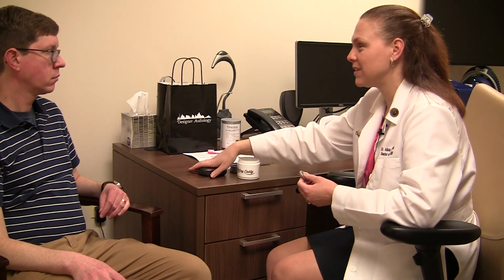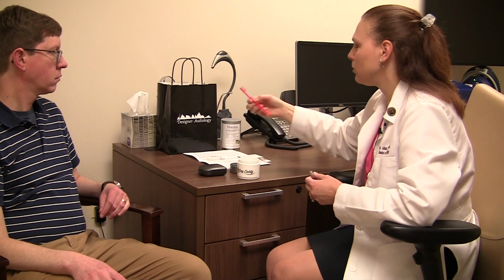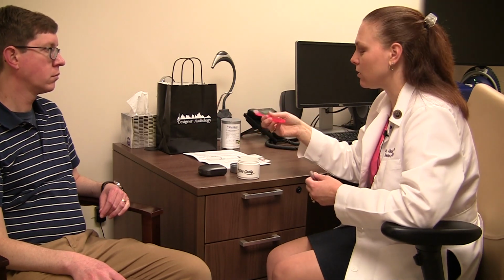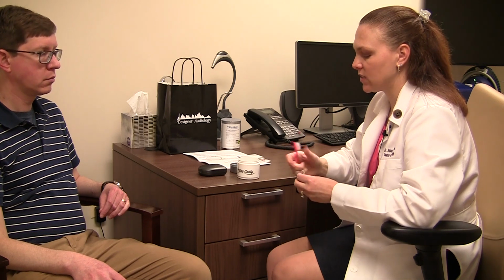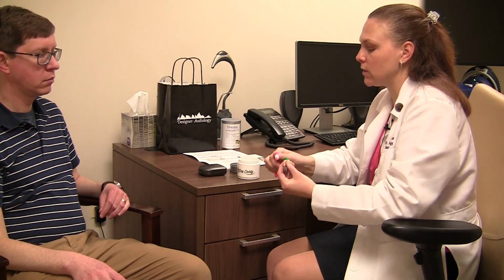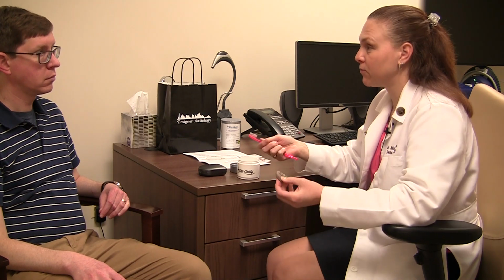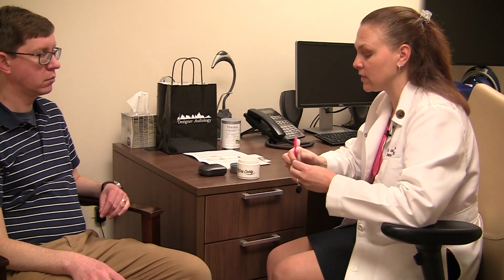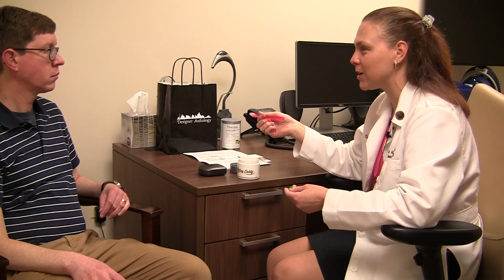Now the hearing aid company sends you a couple cleaning tools that I've put in your goodie bag for you, but I'm a big proponent of a toothbrush. So the toothbrush is soft and dry, and you can just brush the part that goes in your ear, and you can brush the part that goes behind your ear. Really quick, really fast, really easy. Every morning, couple seconds, both devices, put them on and you're ready to go. So nothing super special about it other than I picked out pink for you.